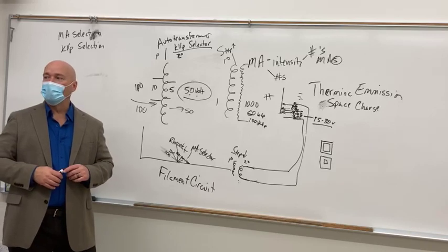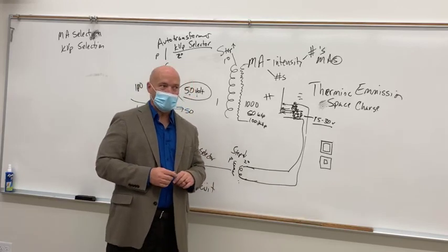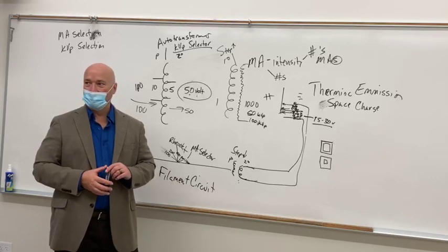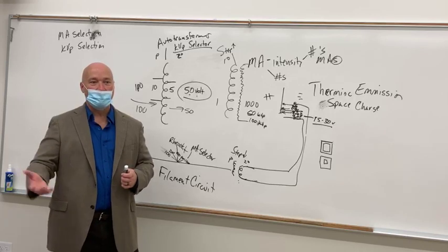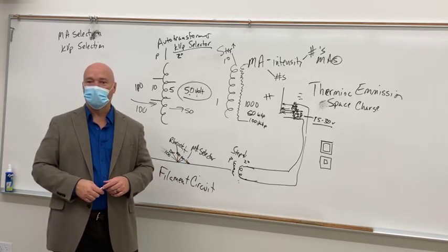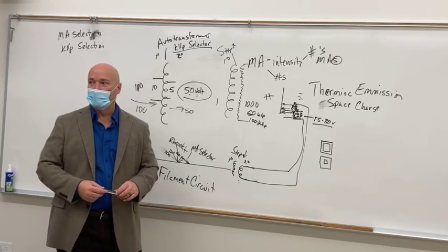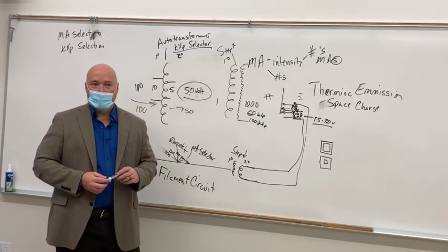Probably not. So do we need real high detail? No. KUB. Can you pick out anything on a KUB yet? No, no, probably not. You will eventually, but right now, you can see spine, pelvis, and maybe some gas patterns, and that's about it, right? Everything looks alike. Do you need to see extremely high detail on that?